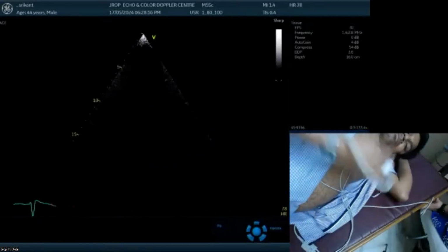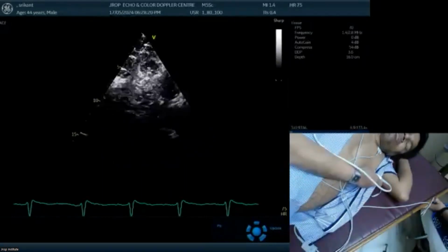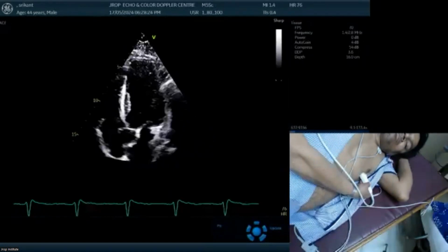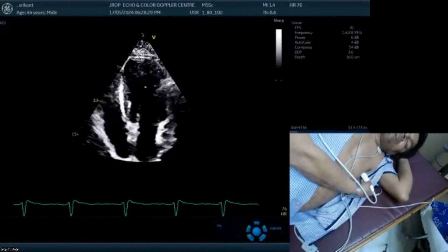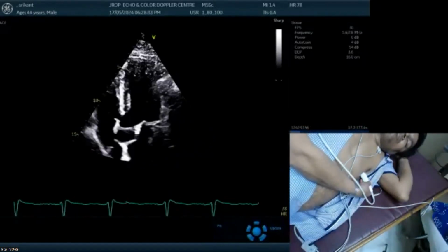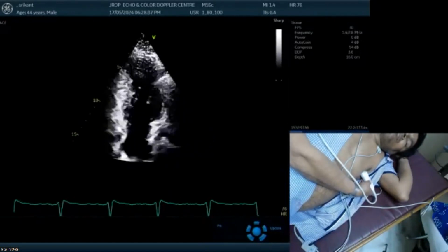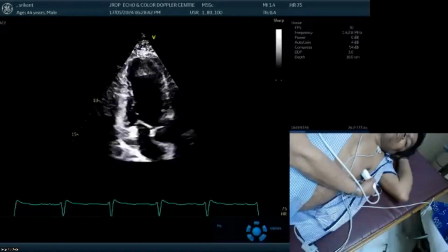So we go back again. I'm perpendicular. If I'm perpendicular, something like this will happen. I have to be almost parallel to the heart. Once I'm parallel to the heart, my footprint is looking towards aorta, the aorta will open. I close my aorta, do a counterclockwise rotation. This becomes 2-chamber view. Further counterclockwise rotation will give me 3-chamber view.